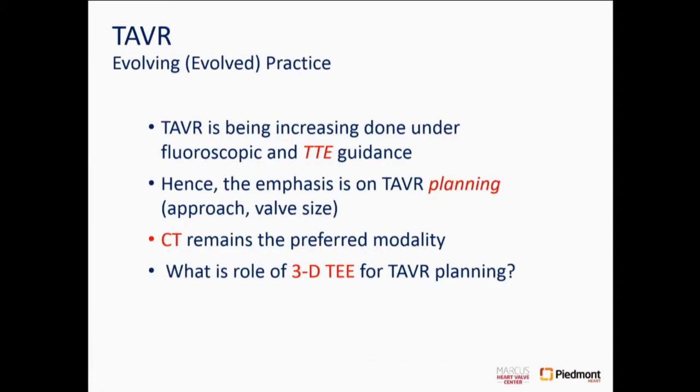So where does 3D TEE actually fit? And I think the place where it fits the best currently is in the planning of TAVR procedure, or in those small number of patients where intra-procedural TEE is still done as the only technique without a pre-procedural CT. But that's few and far between.